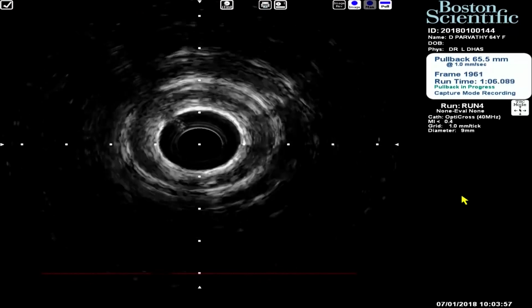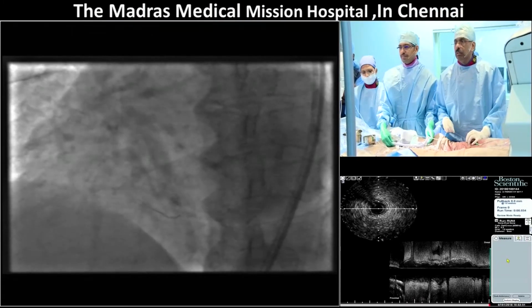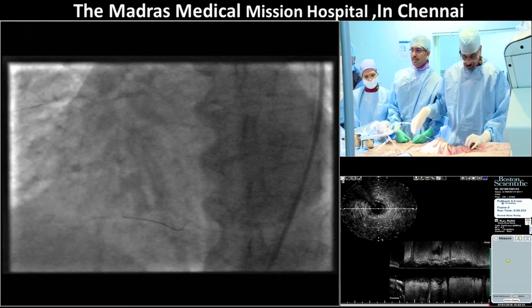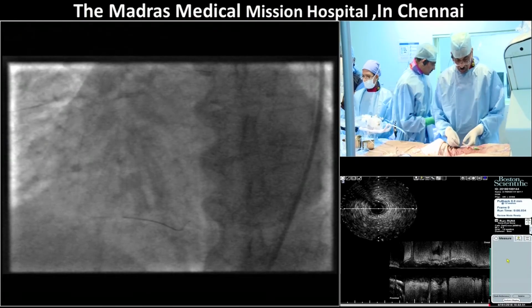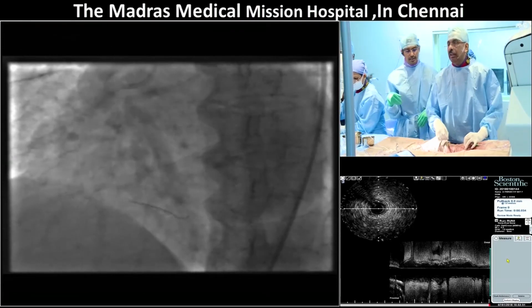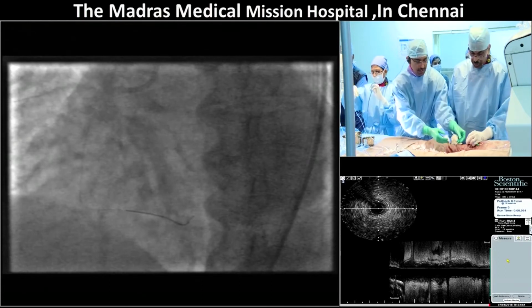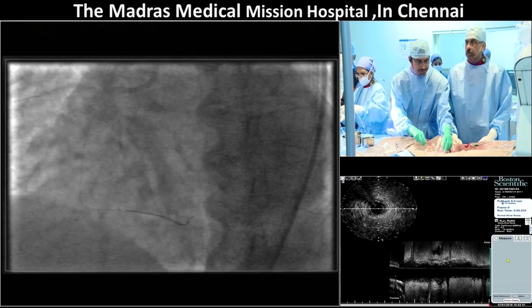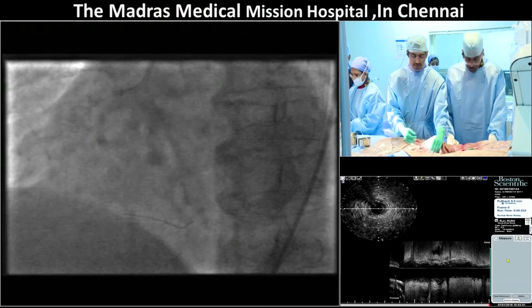Put it off, please. So we are very sure that we are inside the lumen. So now if you want, we can take a picture. Now you are very sure, yeah. Ajit, now you are very sure that you can inject now, yeah. The advantage of IVUS that you have in your hand, as Vijay said, is that you're damn sure what you're doing, and now we can very confidently take an injection.